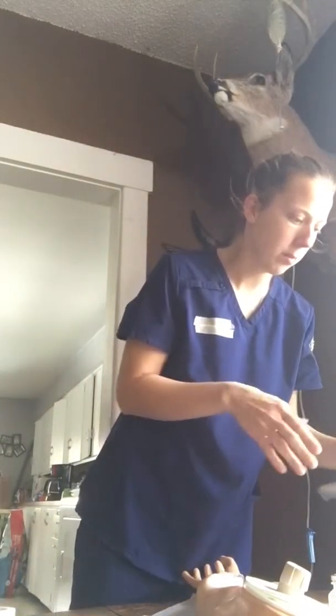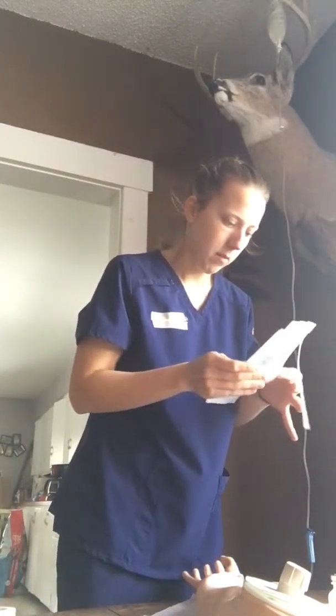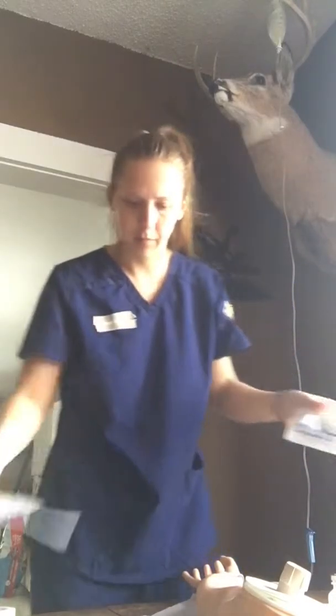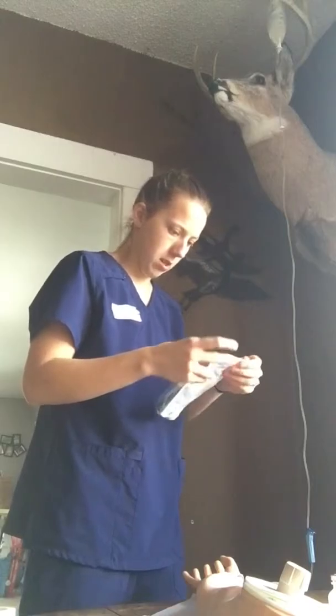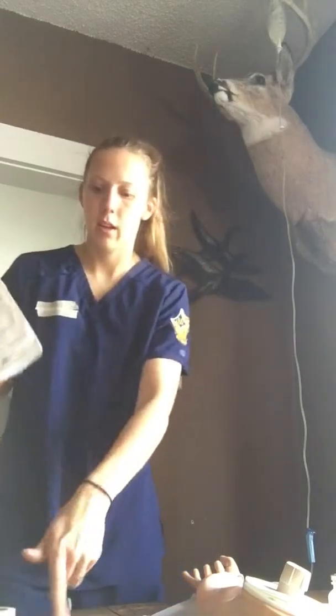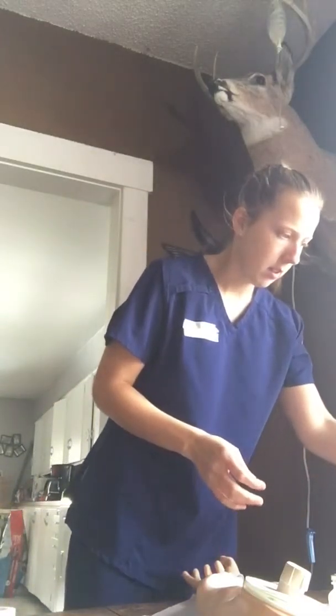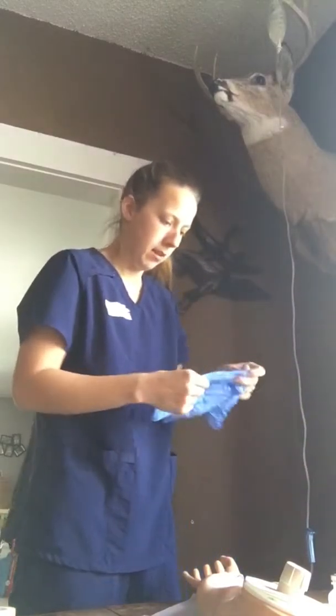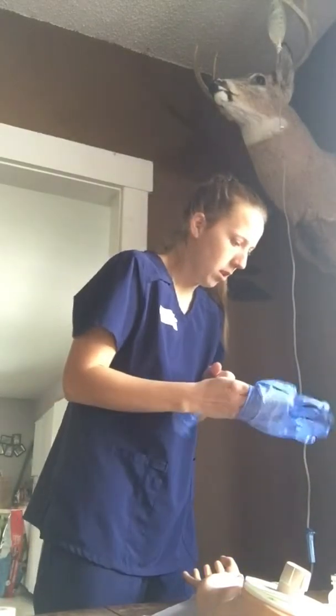First, we're going to wash our hands, check our MARs, and get our supplies that we need. Here we have our bag and our IV piggyback, and we have our Dilaudid and our normal saline.